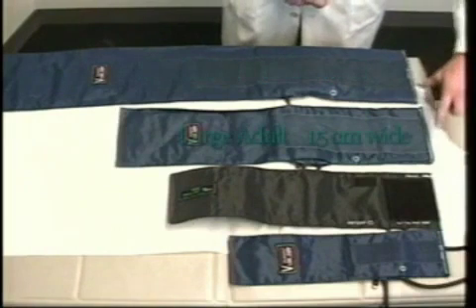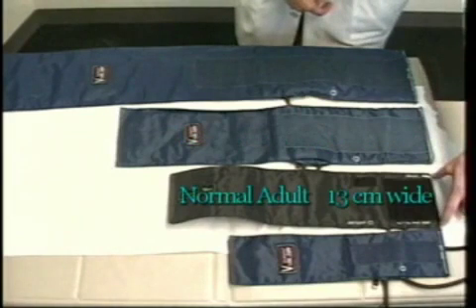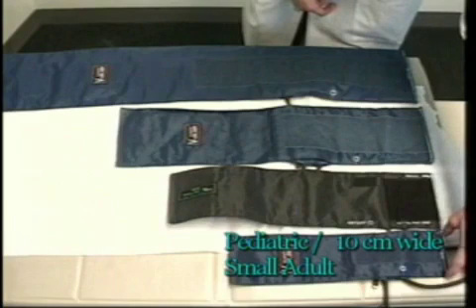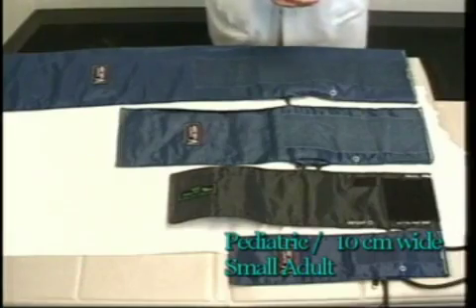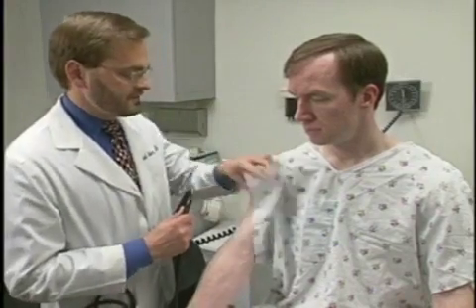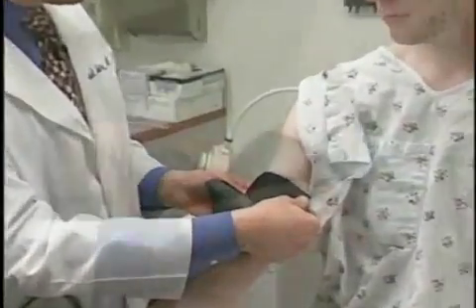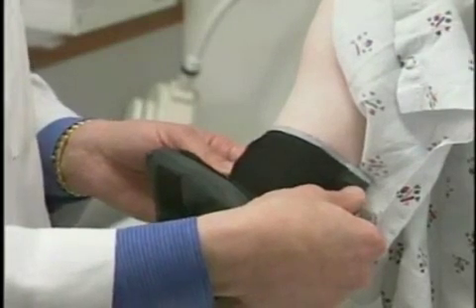The next largest cuff is known as a large adult blood pressure cuff, and this one is approximately 15 centimeters wide. Then we have the normal adult blood pressure cuff, and it is about 12 or 13 centimeters wide. And finally, we have the smallest blood pressure cuff, which can be known as a pediatric or small adult cuff, and this one is about 10 centimeters wide. To determine which cuff is appropriate, we need to measure 2 different variables on the arm. We measure the width of the blood pressure cuff against the patient's arm. The width of the blood pressure cuff should be approximately 40% of the circumference of the arm.